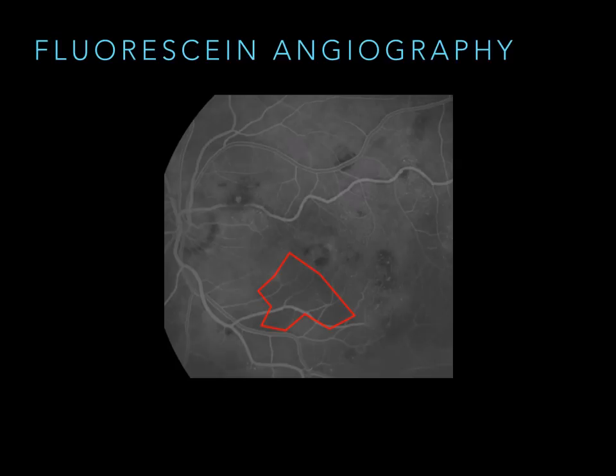You could barely tell. In fact, let's see if I can go back one build. Yes. All right. So you can barely tell that right in the center, it's a little bit darker. It's kind of like a lazy T-shaped thing. And as you can see on my next little outline there, I'm outlining this area. It's a little darker. You can see vessels.